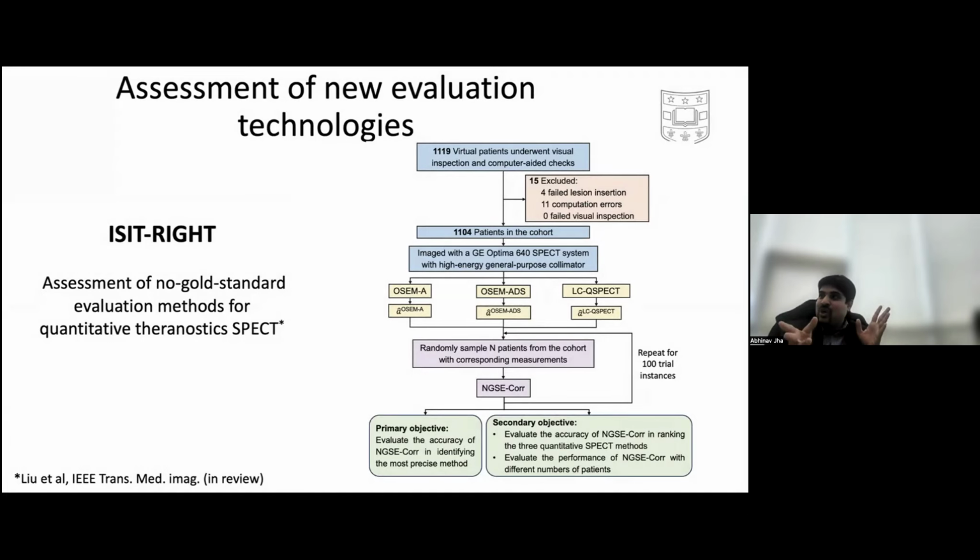So let's say the task is quantifying tumor volume. I don't know what the true tumor volume is. And I can have a physician draw a tumor volume for me, but the physician-defined tumor volume may have its own source of errors. So then how do we do evaluations when we don't have ground truth? So, Farishte comes up with her segmentation method, and then there are two other competing segmentation methods, and she wants to show my method is the best. She uses clinical data for that purpose. How does one show as an investigator that my methodology with clinical data works well?